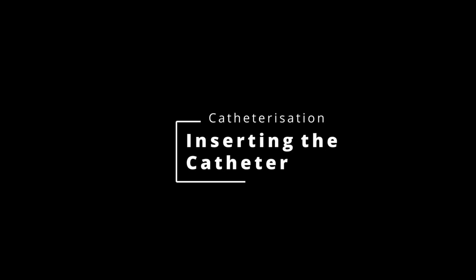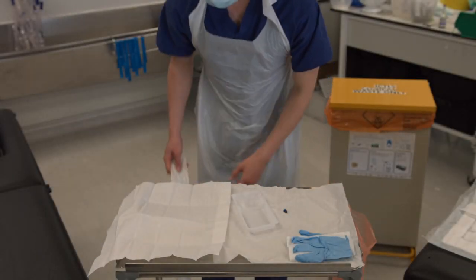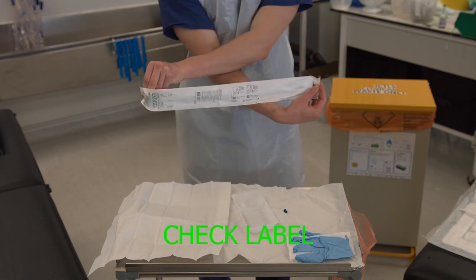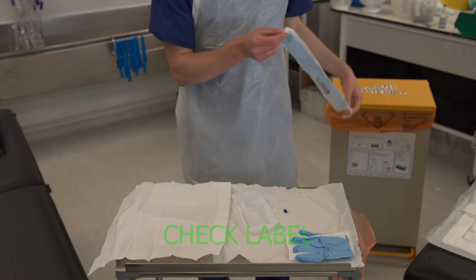This video will show you how to prepare the catheter for insertion into the urethra. To begin with, check the label on the catheter, ensuring it is size 12 to 14 French for a male pelvis.